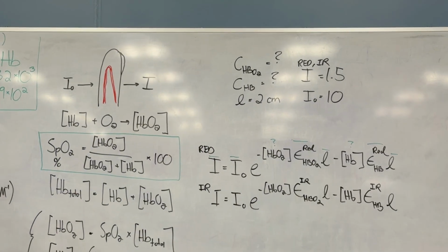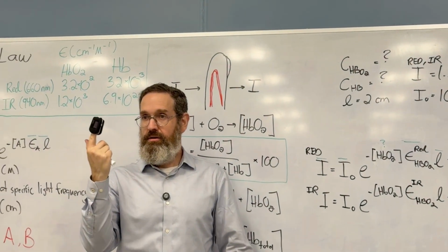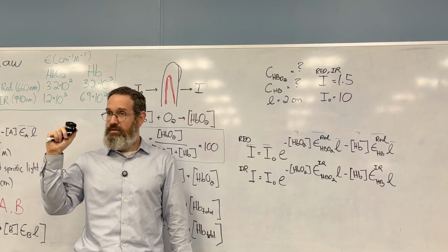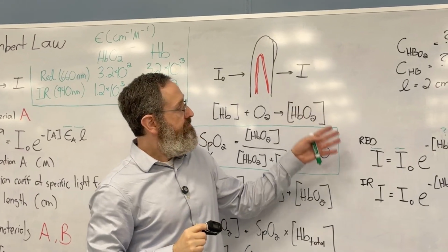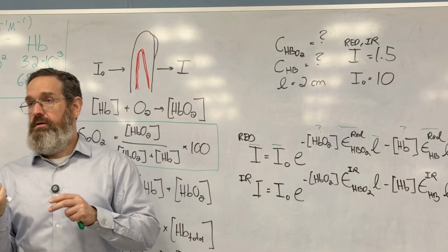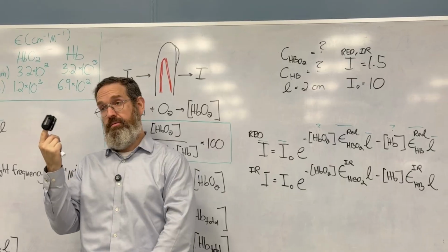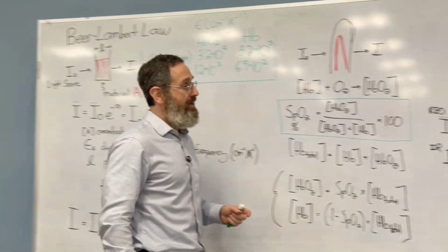I've solved pulse oximetry. I just need to make sure there's 2 light sources in here. One is on, the other one off, take turns maybe, red, infrared, each one takes a turn. And then this has a little processor in it. It will detect the light, and then it will do a little bit of math. Well, not quite, okay?